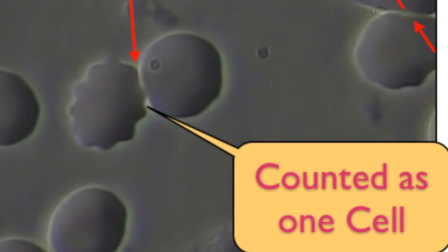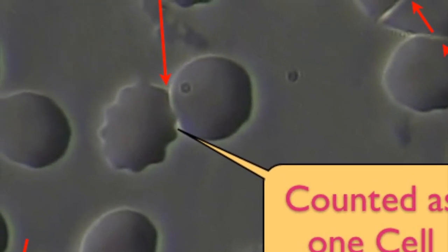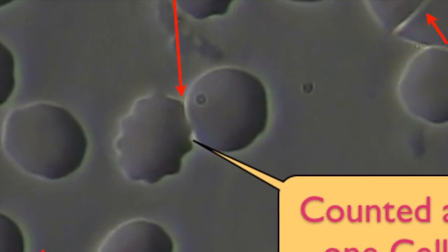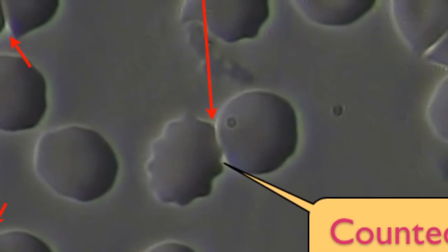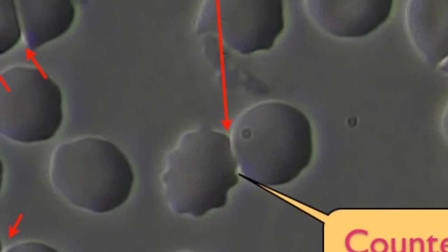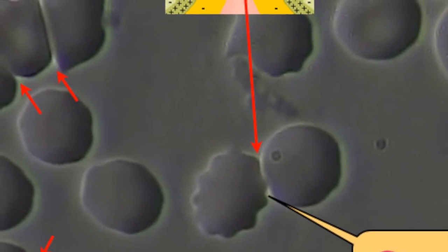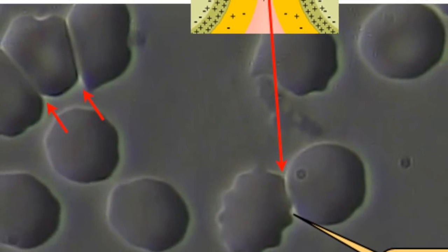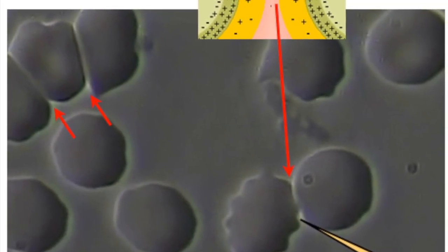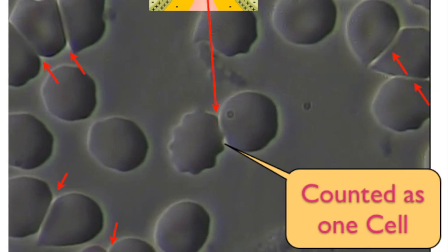While the automated cell counters are fast, convenient, and precise, certain conditions can interfere with the machine's calculations and result in spurious or erroneous results, simulating a symptom or a condition without being pathological or morphologically genuine. It is important that clinicians become familiar with the more common causes of these spurious results with the electronic counters.